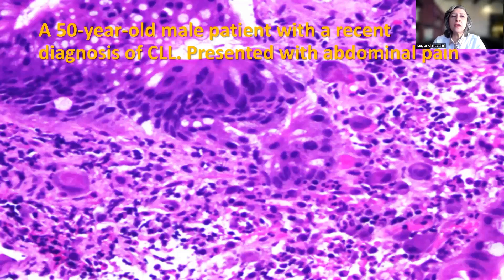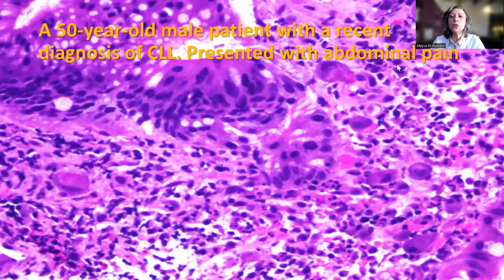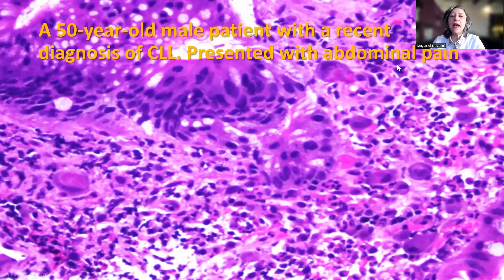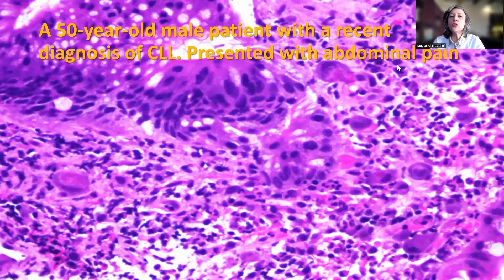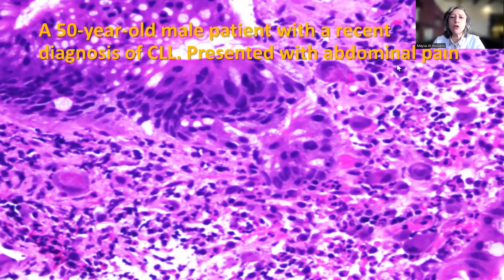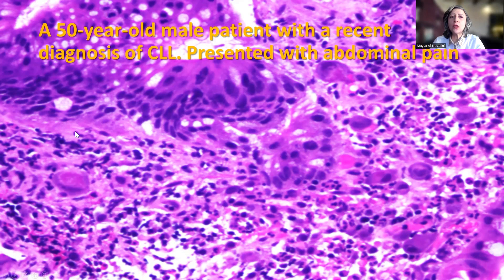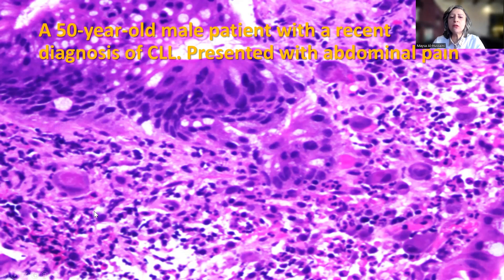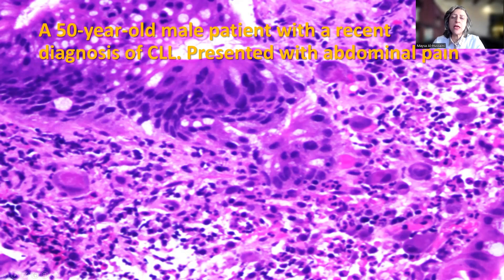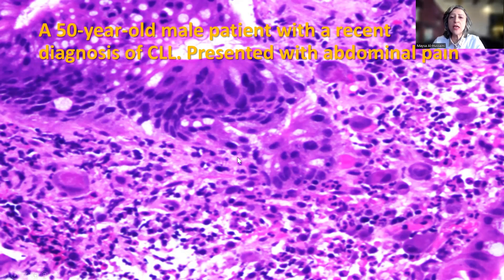This is the first case: a 50-year-old male patient who had a recent diagnosis of CLL and presented with abdominal pain, so he underwent upper and lower endoscopy. This is the colonic biopsy, and as you can see, there is a lot of inflammation. I'm going to share with you an area of ulceration as well as reactive epithelial changes.